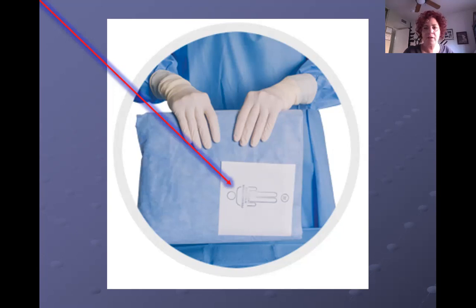So when we have our first drape, where do you think, if we are placing the drape, where we are going to place it? This never changes. Where do we place the drape? The book tells us, if you look in there. On like the, where you're gonna make the incision? Yes, you are absolutely right. Thank you, Tom. And so over the incision site, right? And sometimes it will be our job to place it, all right? And I'm gonna let you guys do that so that you get the experience of that as well. Absolutely, good job.